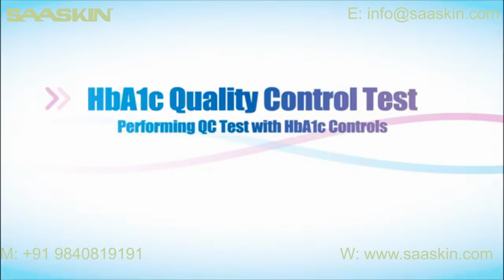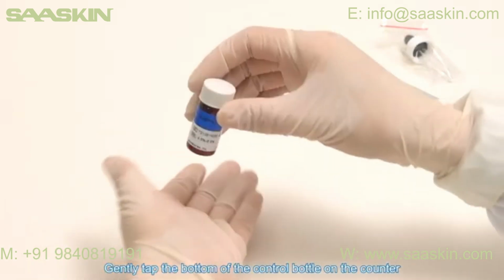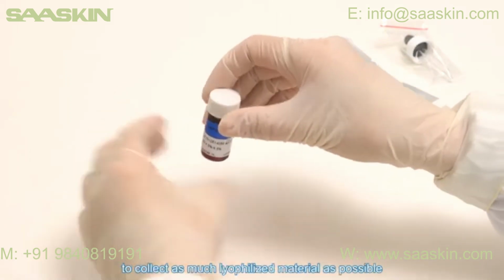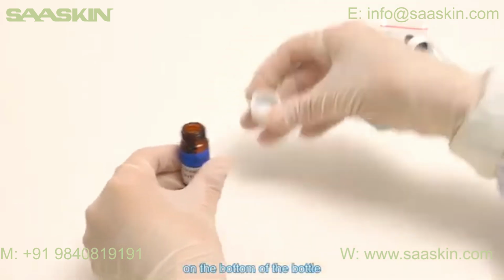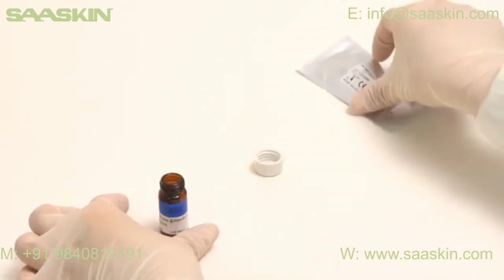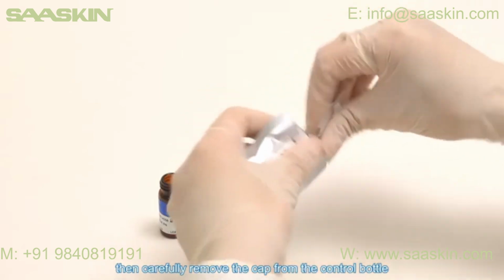Performing QC test with HbA1c controls. Control solution reconstitution preparation. Gently tap the bottom of the control bottle on the counter to collect as much lyophilized material as possible on the bottom of the bottle. Then carefully remove the cap from the control bottle.